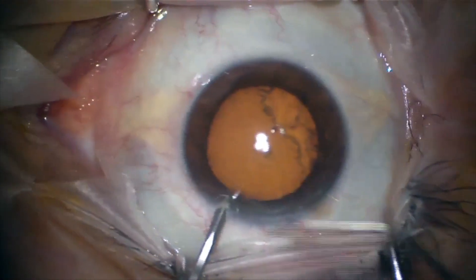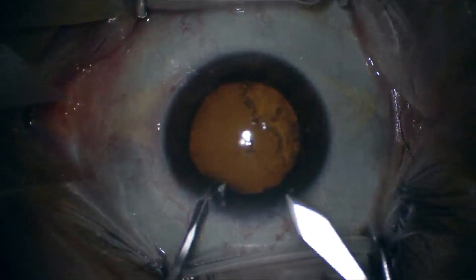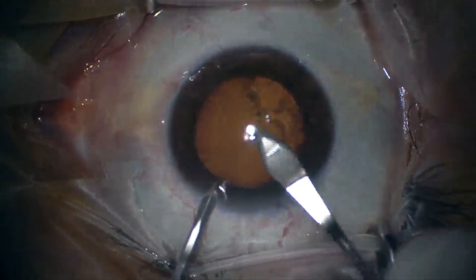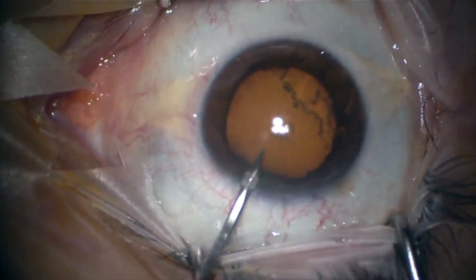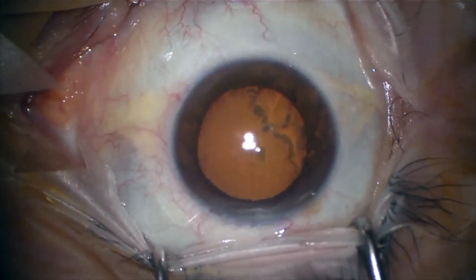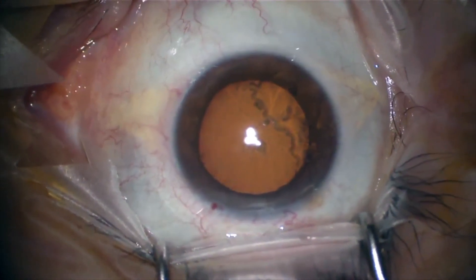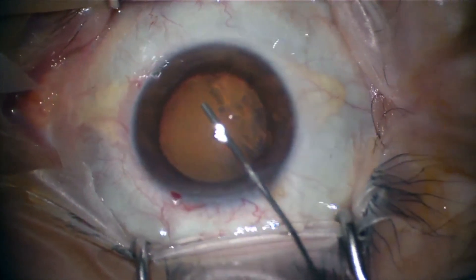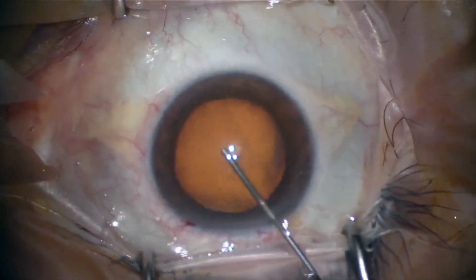This is our first video on this channel and we're going to talk about quick cataract surgery using phacoemulsification technique. First, we do the first 2.2 millimeter incision and lateral incision, and we have a nice microscope.